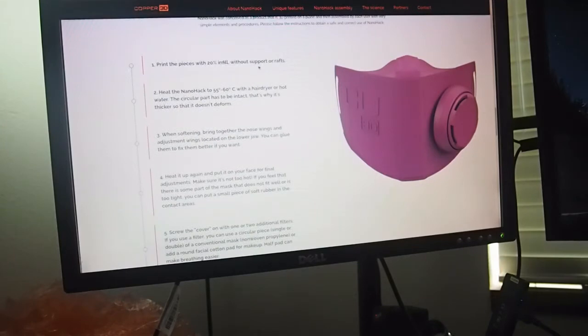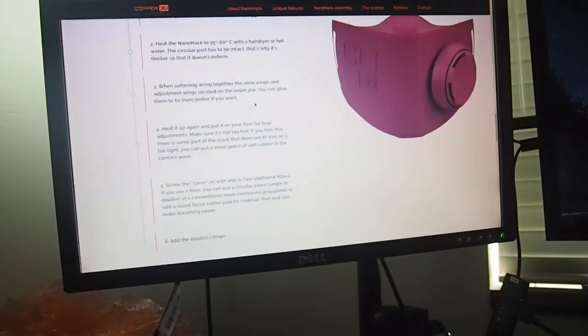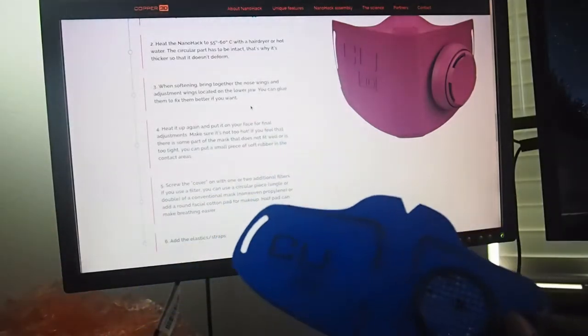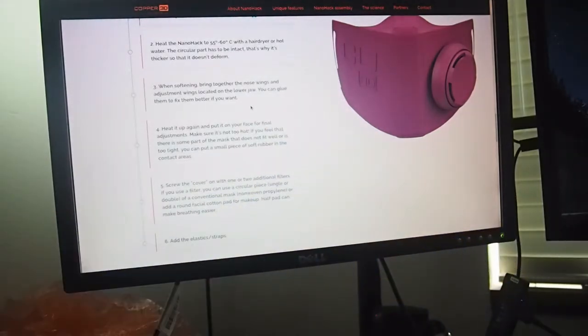You're going to print these with 20% infill, no supports, no rafts. You're going to heat this thing up with a hair dryer or in an oven or something. Try not to heat the actual filter vent portion. And then when it's soft, you're going to put this on your face and kind of bridge it around. I haven't tried it yet, so I'm going to print a couple before I start trying to form fit them, so I can learn in a quick rapid fire fashion how that deforms. And you're just going to keep reheating it until you get it right.